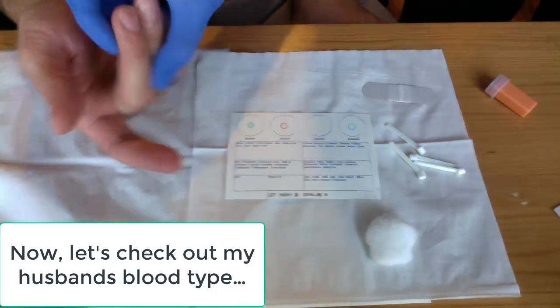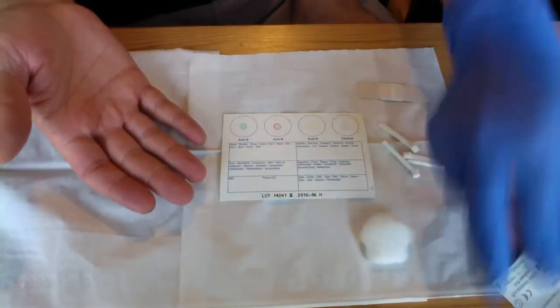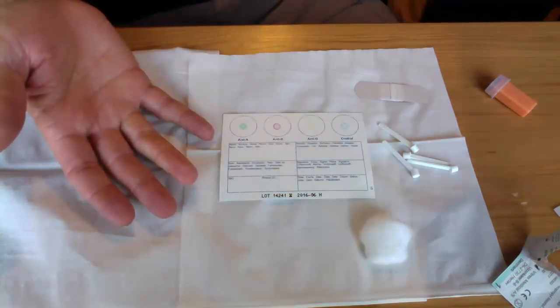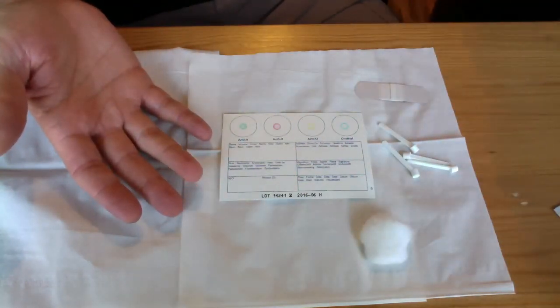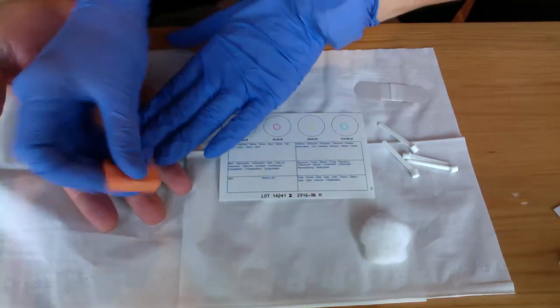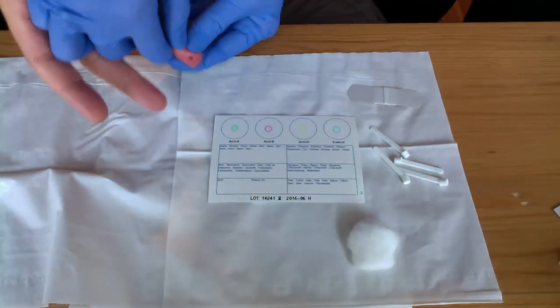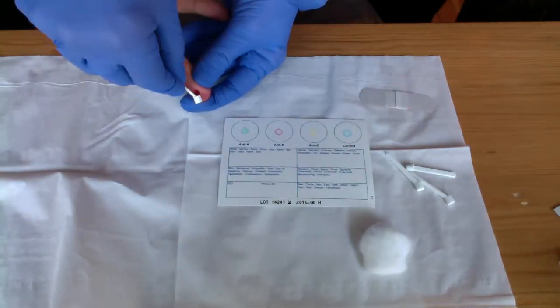Okay, so I'm going to do this on my husband, because I know that I'm type O, and I believe he's type A, but we're going to find out because I can't remember. So again, I'm just going to alcohol swab his 4th distal phalanx, and he's going to be okay with this, I think, maybe. I'll let it dry. I have to do it on the side of it. Okay, so again, I'm just going to quick prick him. Oh, it's over. Look, there you go. And then you have to push his hand down and really milk it. This kit is nice because it has these little cups.